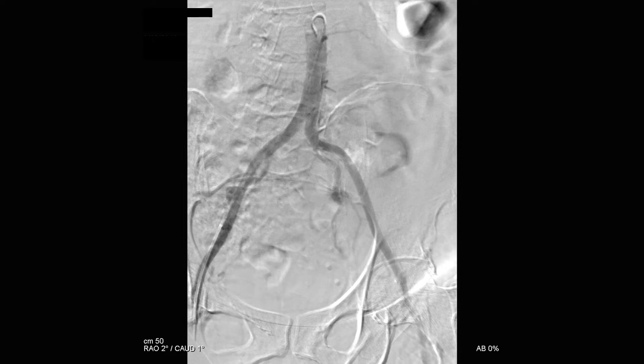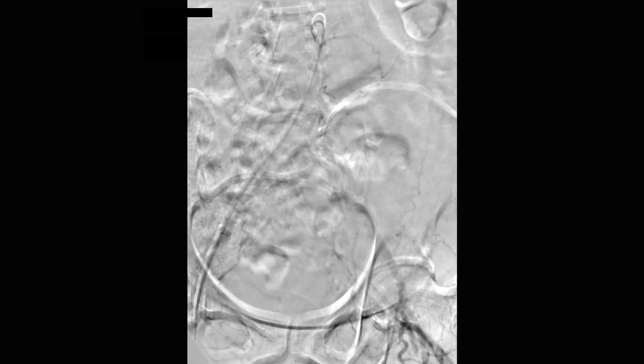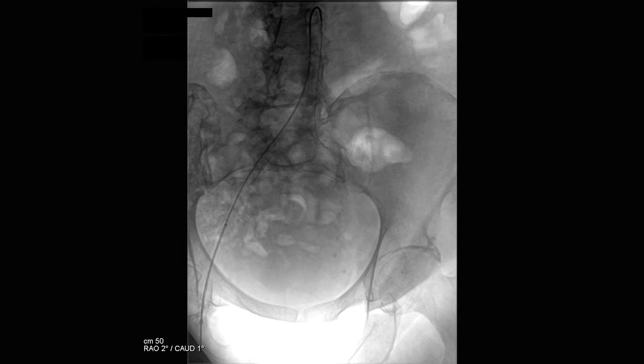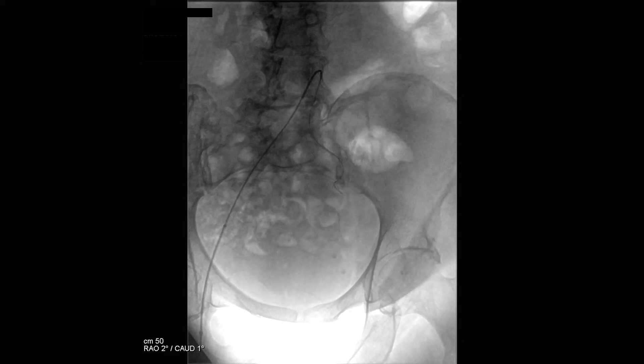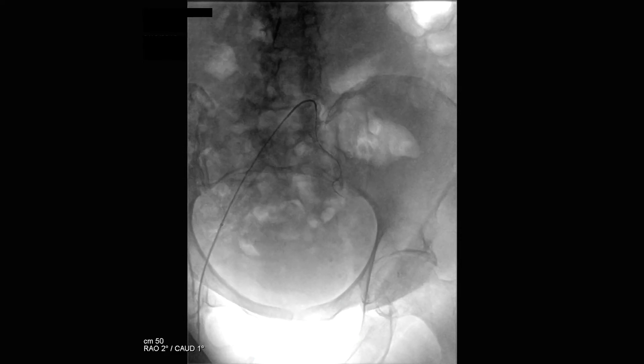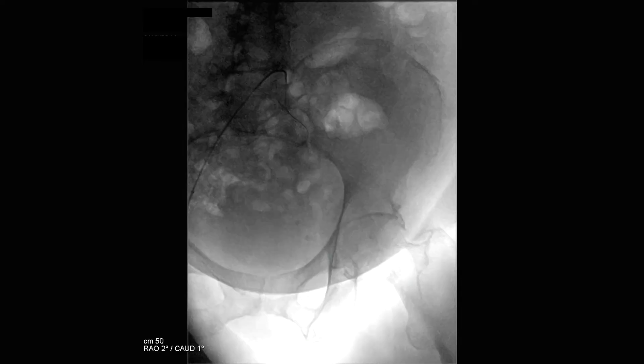In this case, the patient is found to have no significant aortoiliac disease. The contra catheter is then used to select the contralateral iliac limb. The wire is then advanced into the iliac artery and the contra catheter is pulled back in order to hook it over the aortic bifurcation.